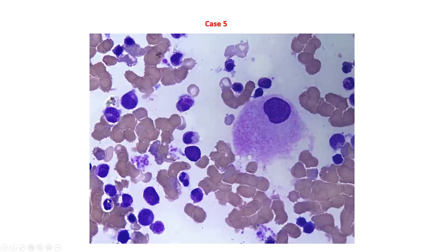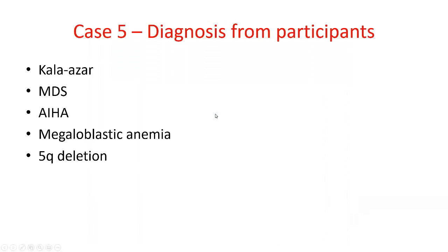Myelopoiesis normal. There were a good number of polymorphs and metamyelocytes. So myelopoiesis was okay. Look at the megakaryocytes. Megakaryocytes were plenty. I would say there was megakaryocytic hyperplasia. And this was on aspirate. What I found was the cytoplasm is mature. I told you that granularity of the cytoplasm appears as the megakaryocytes mature. But the nucleus is not lobulated as it should be in a normal megakaryocyte. This was rounded. Here there was a slight notch, but in the majority of the megakaryocytes, this was just a rounded eccentric nucleus.